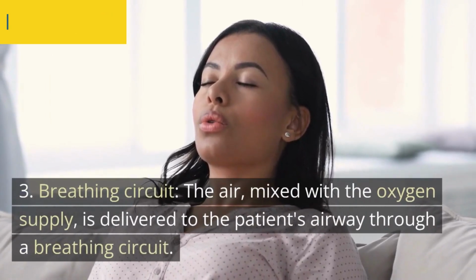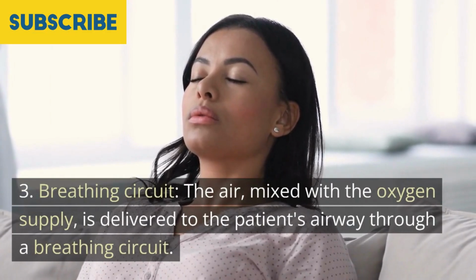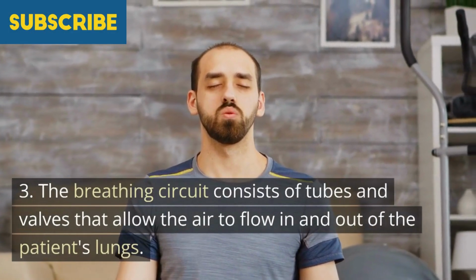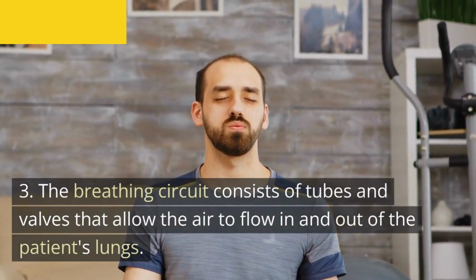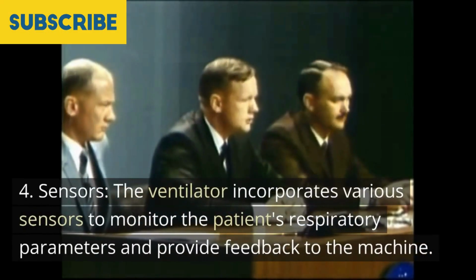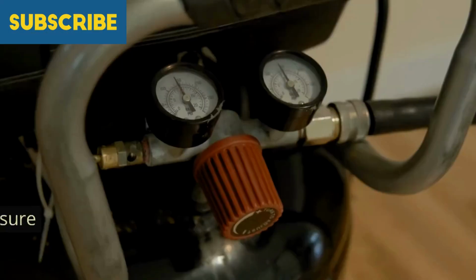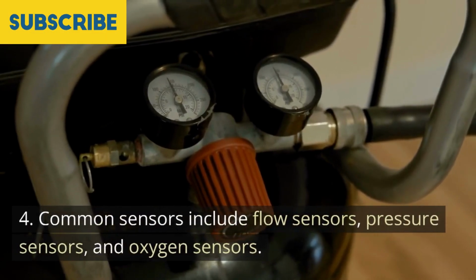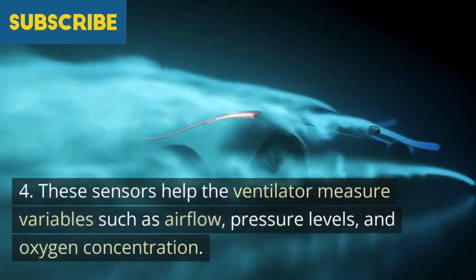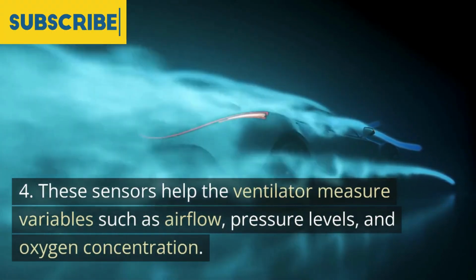3. Breathing circuit. The air, mixed with the oxygen supply, is delivered to the patient's airway through a breathing circuit. The breathing circuit consists of tubes and valves that allow the air to flow in and out of the patient's lungs. 4. Sensors. The ventilator incorporates various sensors to monitor the patient's respiratory parameters and provide feedback to the machine. Common sensors include flow sensors, pressure sensors, and oxygen sensors. These sensors help the ventilator measure variables such as airflow, pressure levels, and oxygen concentration.